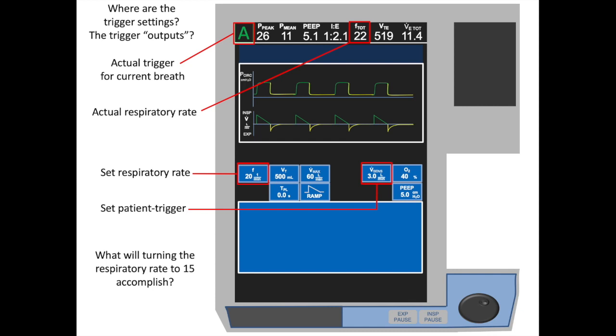In that case, I would say turning down the set respiratory rate is probably the right thing to do to make sure the patient makes some efforts. On the other hand, if every breath is patient-triggered, that doesn't necessarily mean that they're trying too hard. Seeing whether or not a patient is really taking really big efforts is something I think we'll get to later in this lecture.